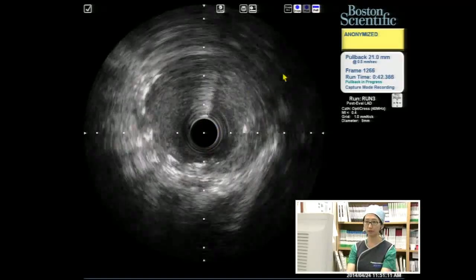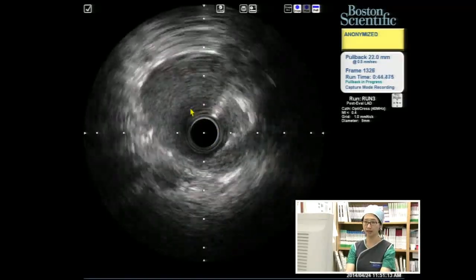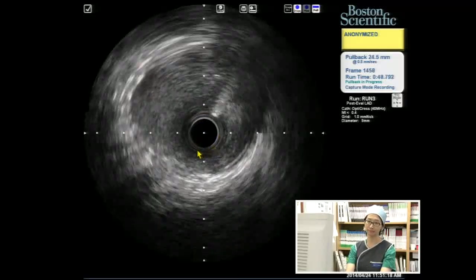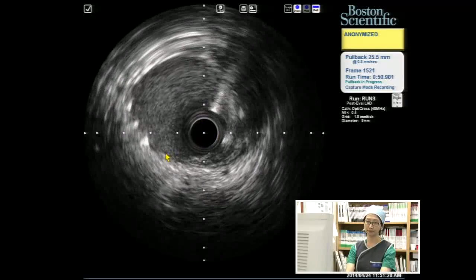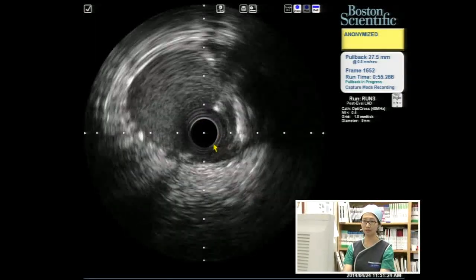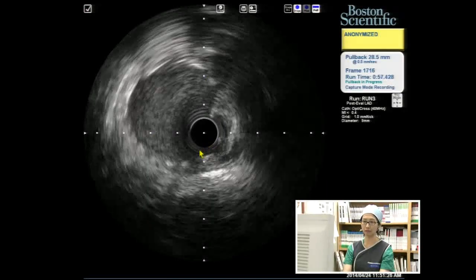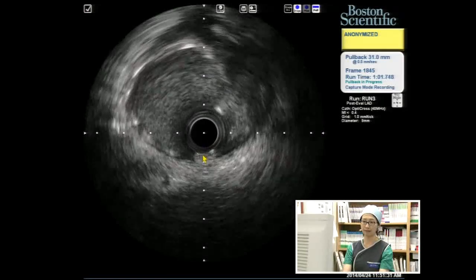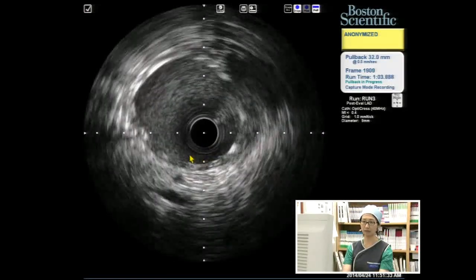And it's the side branch, well open to the LAD. And so far, the result is so good. The stent area is larger than 8 square millimeter, and we have the cutoff value at the LAD ostium. It should be 6 square millimeter of the minimal stent area.